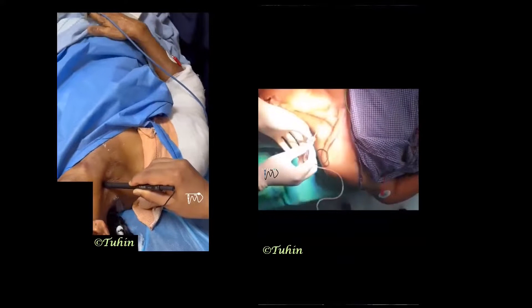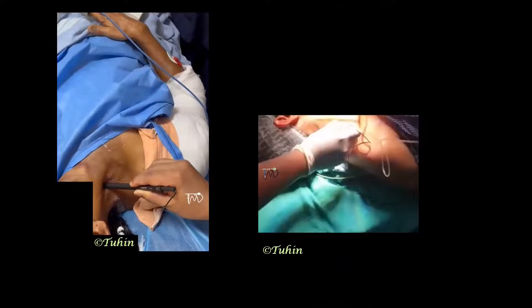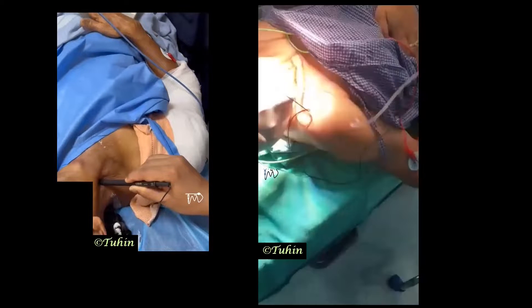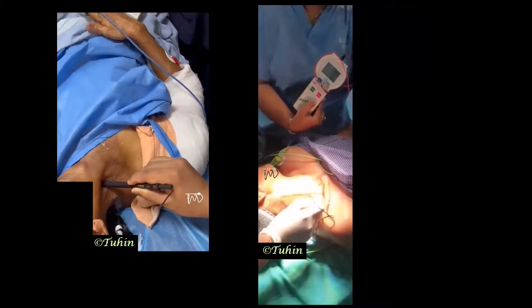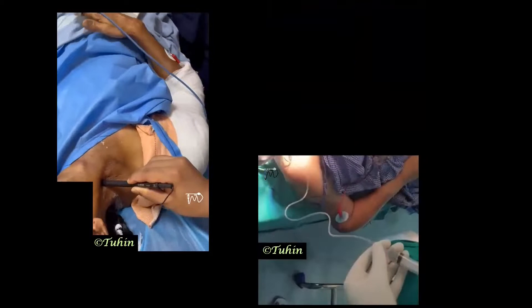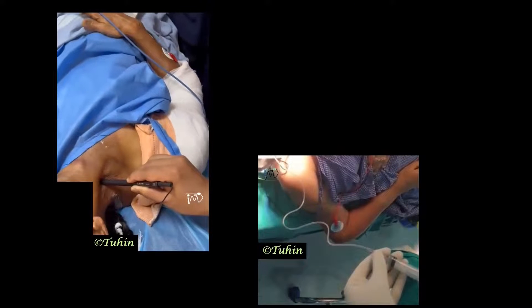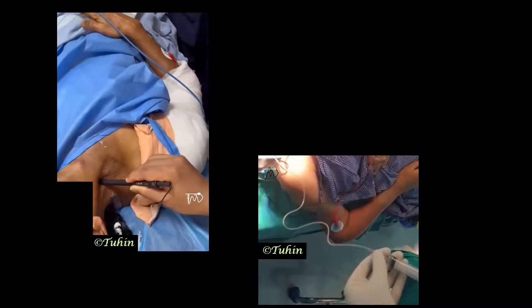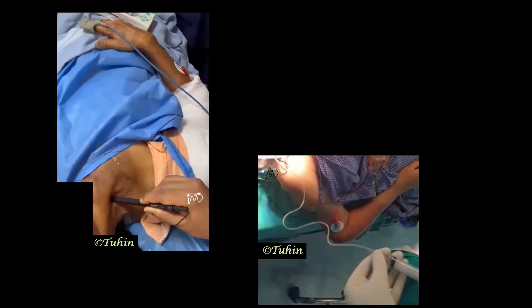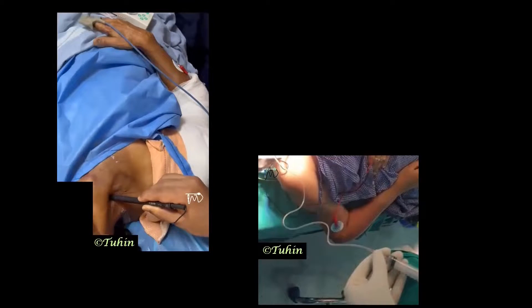The needle is inserted perpendicular to the skin and advanced slowly. After getting the desired motor response, the current is reduced from the initial setting of 1.5 to 0.5 mA. The twitches must be visible at 0.4 mA and should disappear at 0.2 mA to prevent intraneural injection. The local anesthetic is injected in 3 to 5 mL aliquots after negative aspiration for blood.